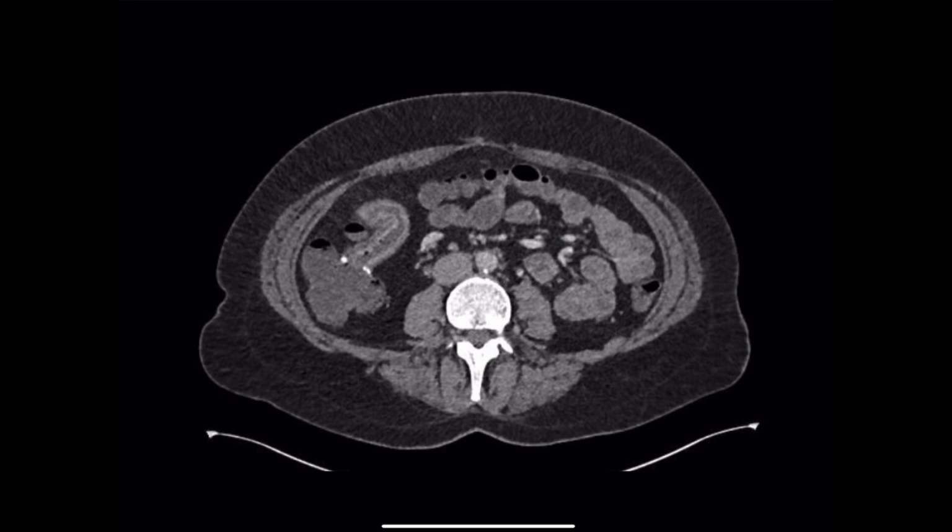So we've done a scan. For Crohn's disease, you can do a CT scan or an MRI scan to firstly check if Crohn's has come back, and secondly to see if there's any complications if the Crohn's has come back, such as obstruction or perforation or local collections. So that's the principal role of imaging. As you just mentioned, Crohn's is a chronic disease that doesn't go away, and our management is centered around trying to keep symptoms at bay and as low as possible.